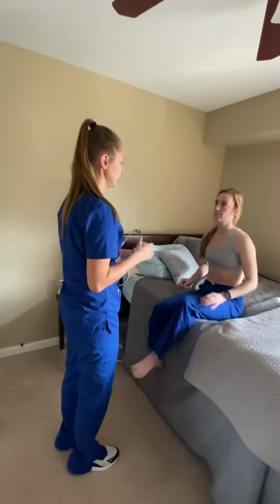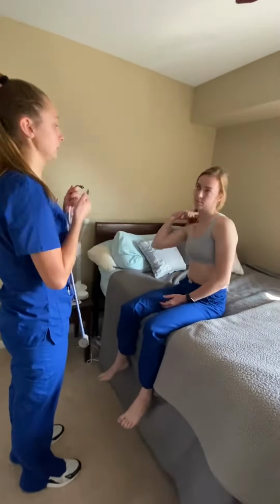And then I'm going to listen to your anterior thorax. Same thing, breathe in through your nose, out through your mouth.